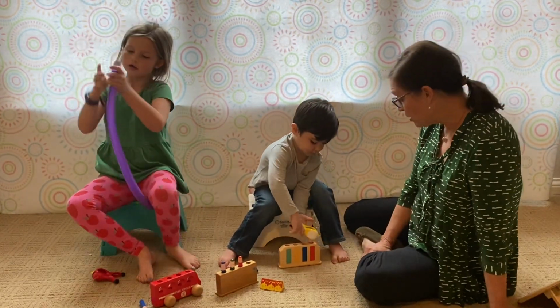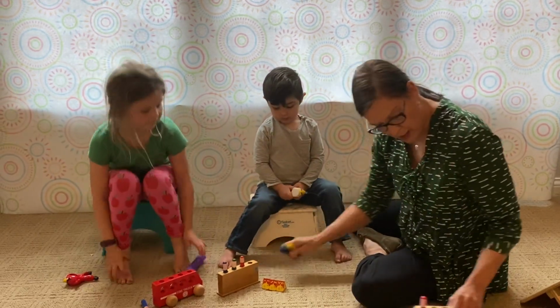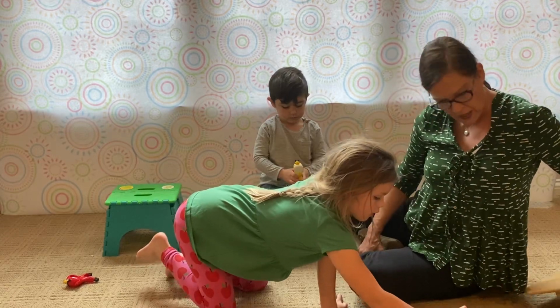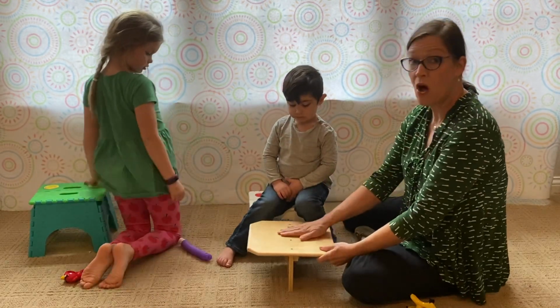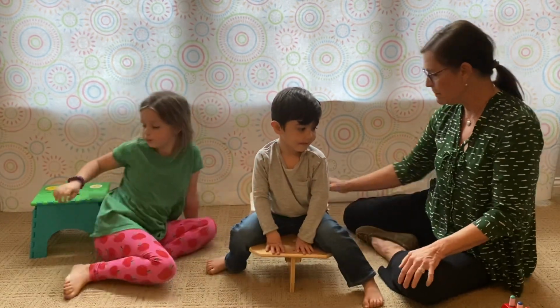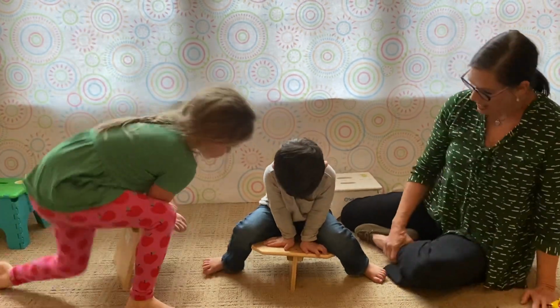So we're going to stop doing this for a minute to show you your favorite toys that you picked out before we started. And you're going to sit on a T-stool. I'm going to move these ones aside because we don't need to work on manipulation right now while they're going to work on postural control. Thank you, Delia. So I have two T-stools. This one is a very small T-stool. And Ezra, this is the second time he's practiced on it. And he's going to work on what's called midline stability. And Delia has never sat on a T-stool. So she's going to try today to sit on one that's more her size.